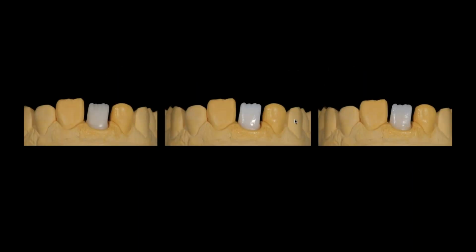And by the way, I know you're listening, Richard. The pink, I think, in the AG system has finally really gotten nice. I'm actually using that in one of the courses here next week. Then I used a more opacified material and a more translucent material. And I think if we kind of look at the patient, we start to say, well, which one of those materials is the right one to meet the needs for this patient?